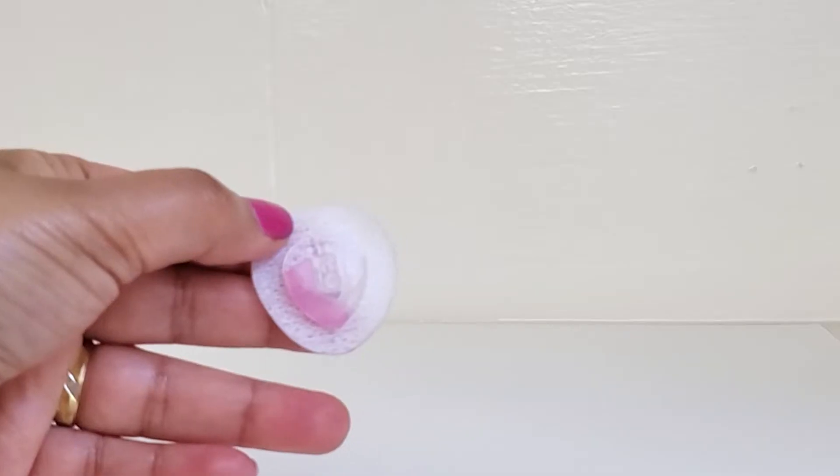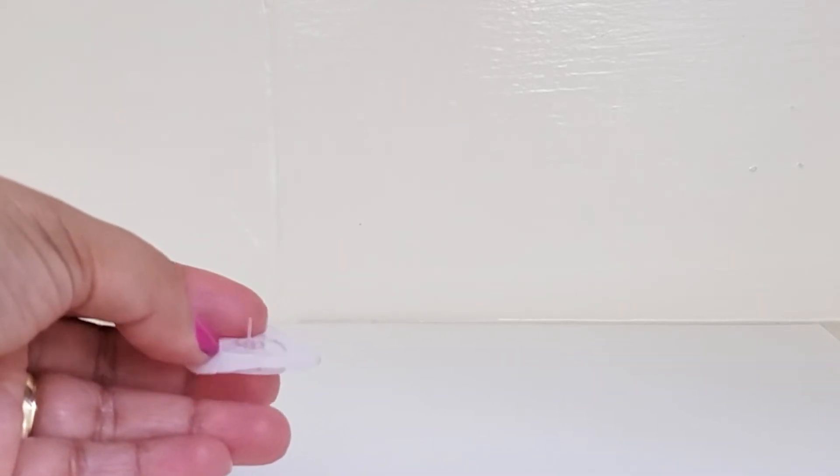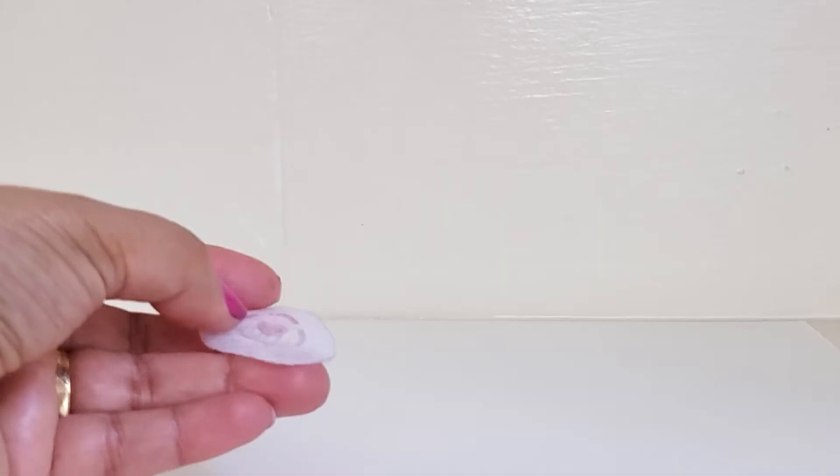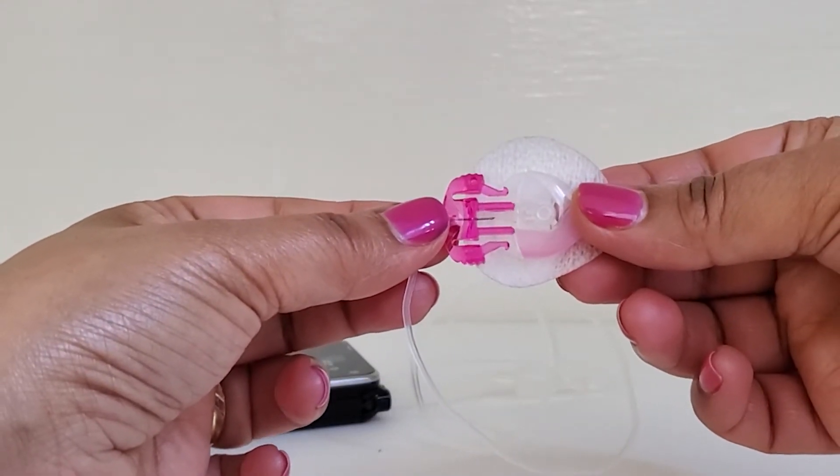This is the pump. This is the cartridge. This is the insulin. This is the infusion set. This is the device. If you are using the insulin pump with tubing, you can add the insulin pump cartridge. You can add the infusion site to the tube.